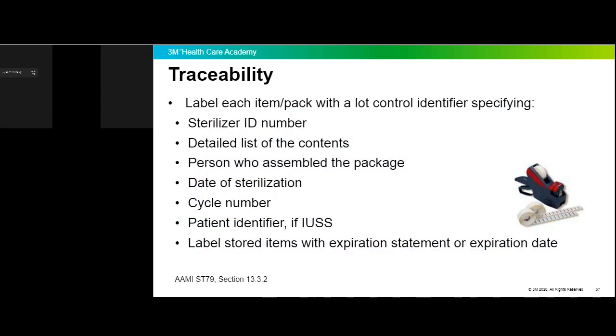Traceability, another perhaps opportunity in clinics to make sure that each item you process could be recalled. You do that by placing a lot identifier on it that says, hey, this was done in sterilizer number 1, load number 2, here's what was in the load, and providing details back to the patient if it was immediate use.